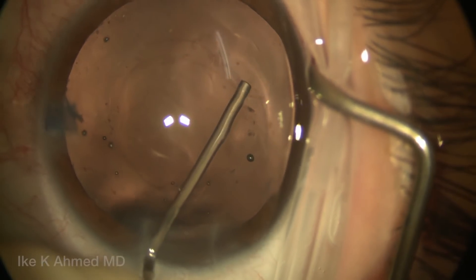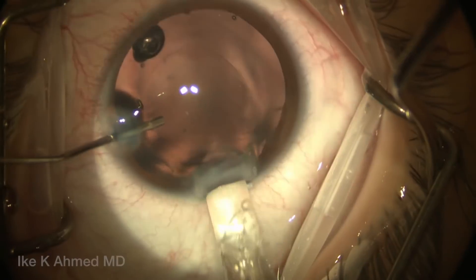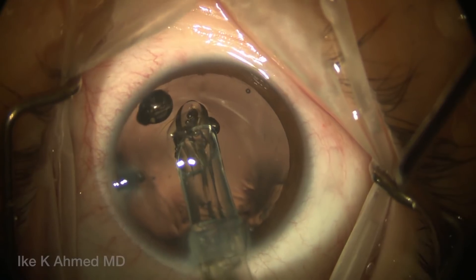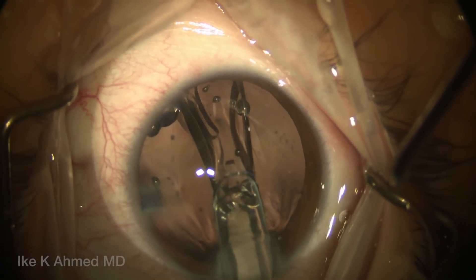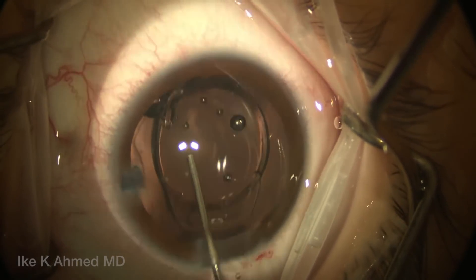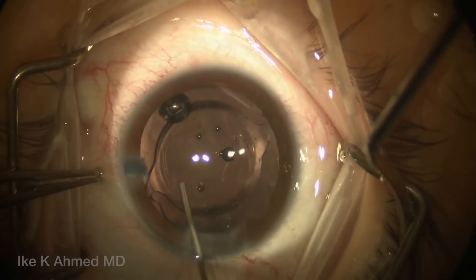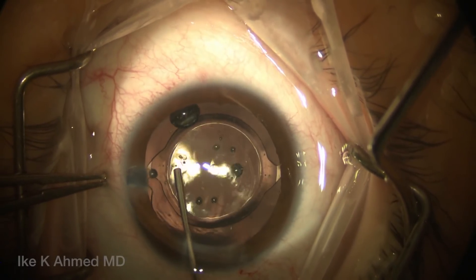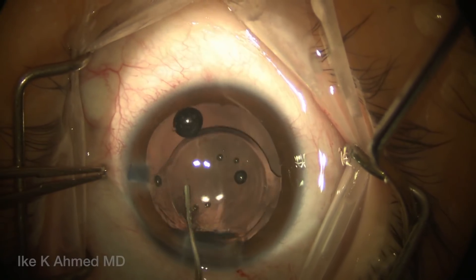We're going to inject some cohesive viscoelastic to separate the anterior and posterior capsule leaflets in preparation for lens implantation. This single-piece clear toric lens — the ZCT400 Tecnis lens — is injected into the capsular bag first. We're going to rotate the lens into its approximate position, slightly under-rotating it if we recall where the marks are made. This lens will account for about 2.75 diopters of corneal cylinder, accounting for this patient's astigmatism.